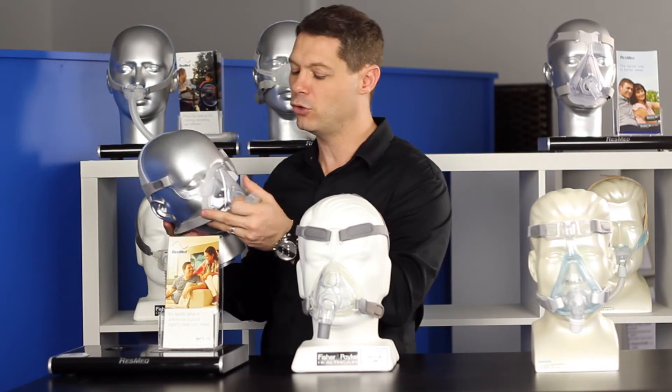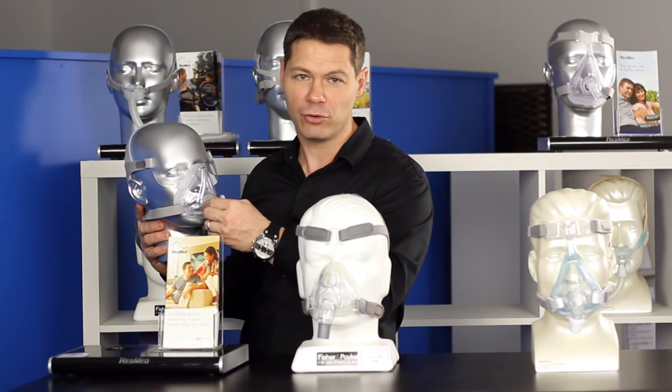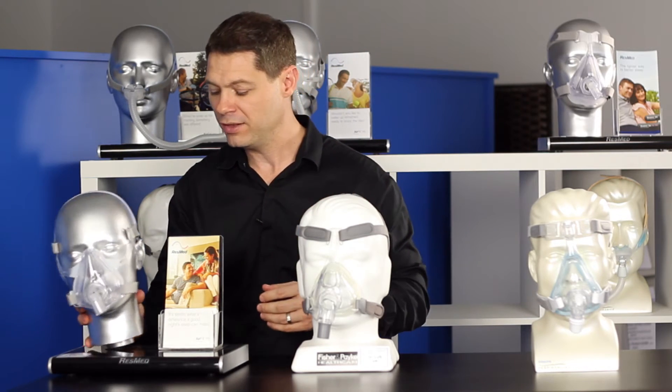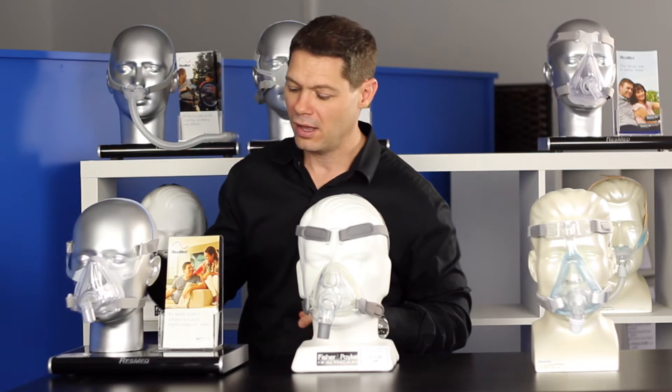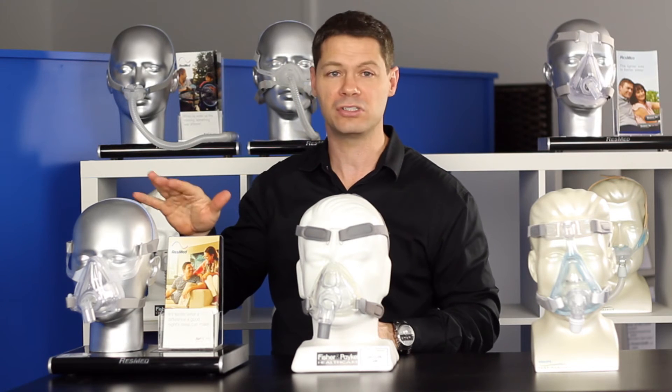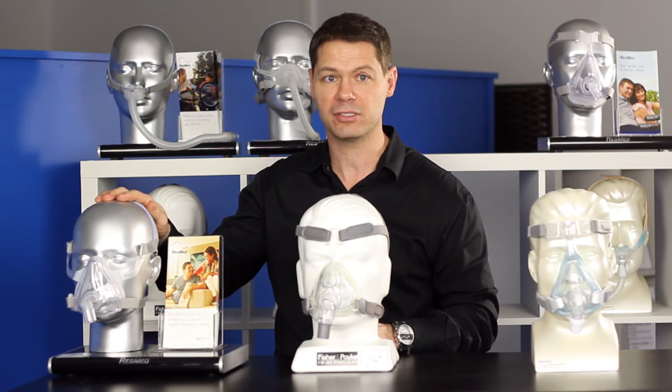One thing I'll mention with all masks: when you're adjusting them, that's what the Velcro is for. The Velcro is not designed to be taken on and off every time you take the mask on and off — that's why they have the clips on the mask, or the hooks that they hook over. If you use the Velcro too often, you will actually lose the stick on the Velcro very quickly and be up for some new headgear.